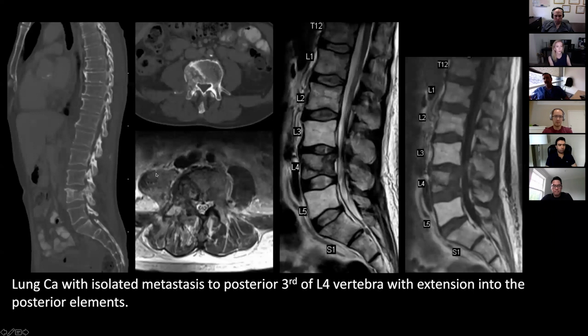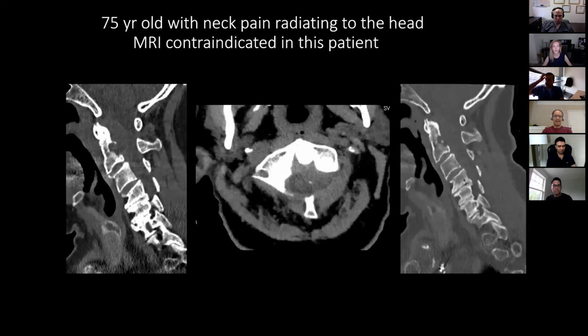So really, if you have to treat this patient, be it radiation or be it surgery or interventional, you really don't need to biopsy this patient. This is straightforward. But obviously, most of the radiation oncologists especially will need biopsies, and that at times can be difficult for certain tumors. This is a patient we just had this week, and I just biopsied this patient 2 days ago, and it was referred from an outside hospital.